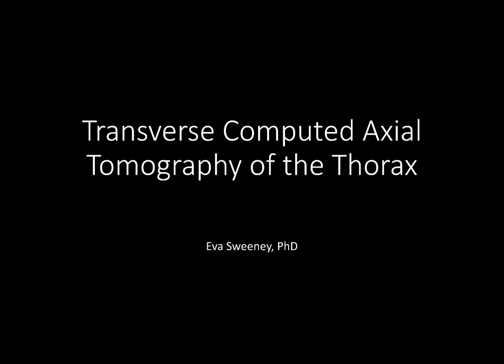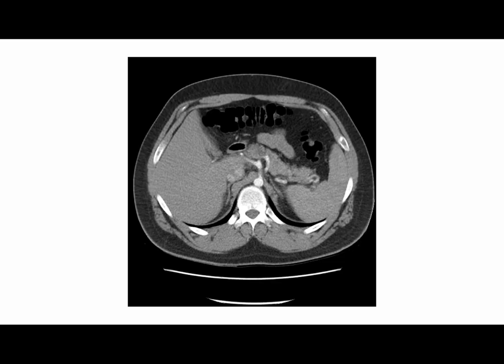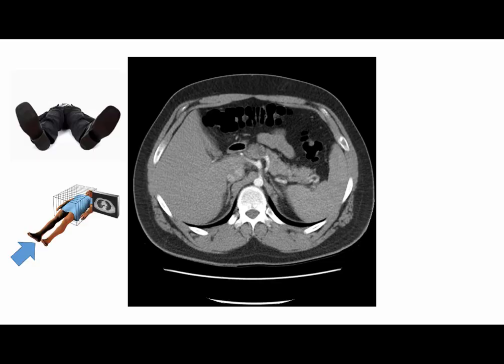This presentation will examine the anatomy visible in the transverse plane of a computed axial tomographical image of the thorax. Transverse CT images are always observed from this orientation, as if we are sitting at the patient's feet. Therefore, this is right and this is left. This CT is of a 25-year-old male and contrast medium was injected prior to acquisition. Typically, contrast medium is an iodine-rich solution injected into the patient via an antecubital vein, which allows us to better visualise vessels.